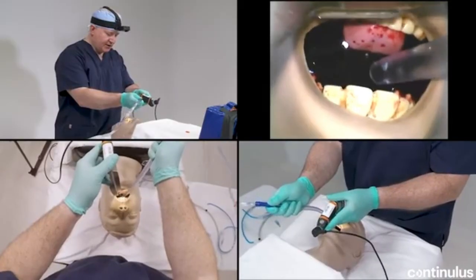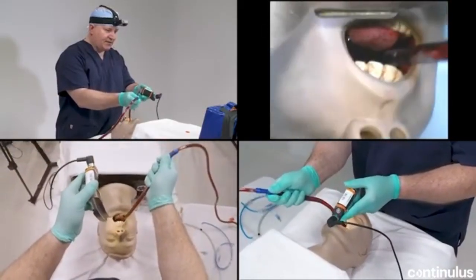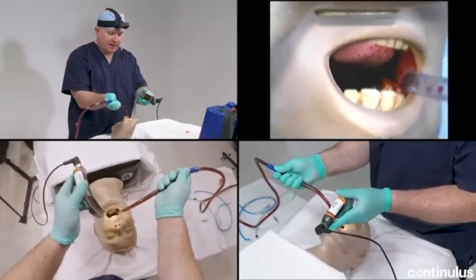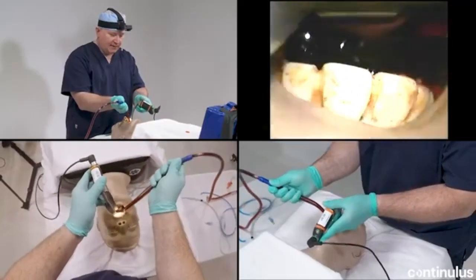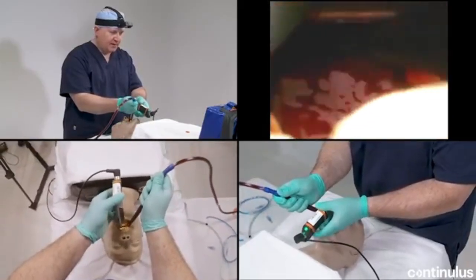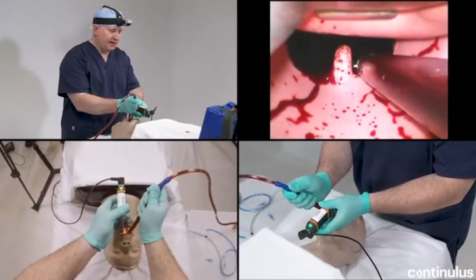I'm going to begin to suction, and as you can see, I'm coming in. If I have active CPR in progress, I'll turn my catheter a little bit more laterally this way so that I can stay out of the way of the rescuers doing CPR. I'm going to evacuate progressively to the posterior palate. We're beginning to see the uvula now come into view.